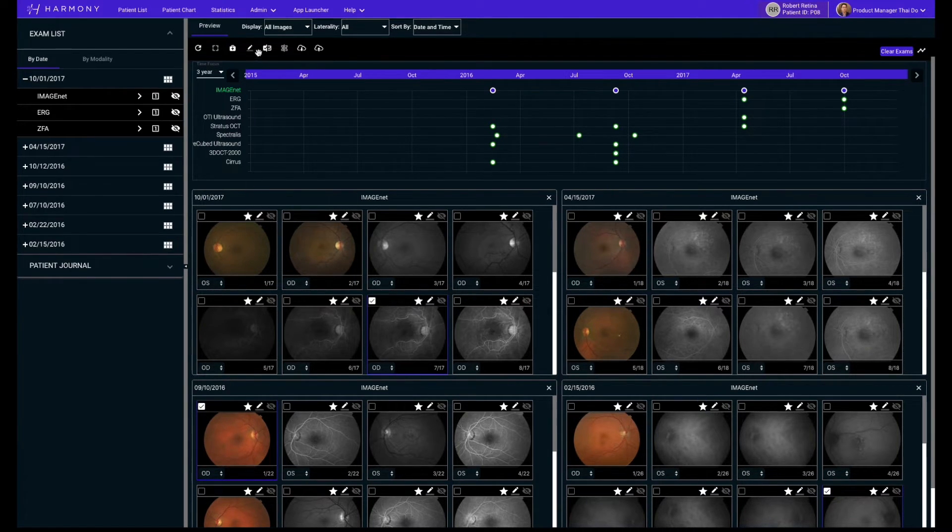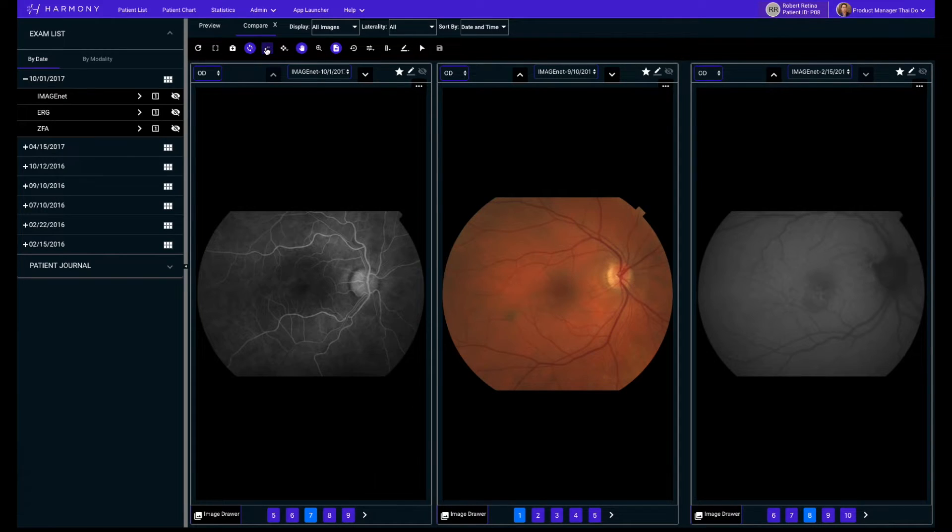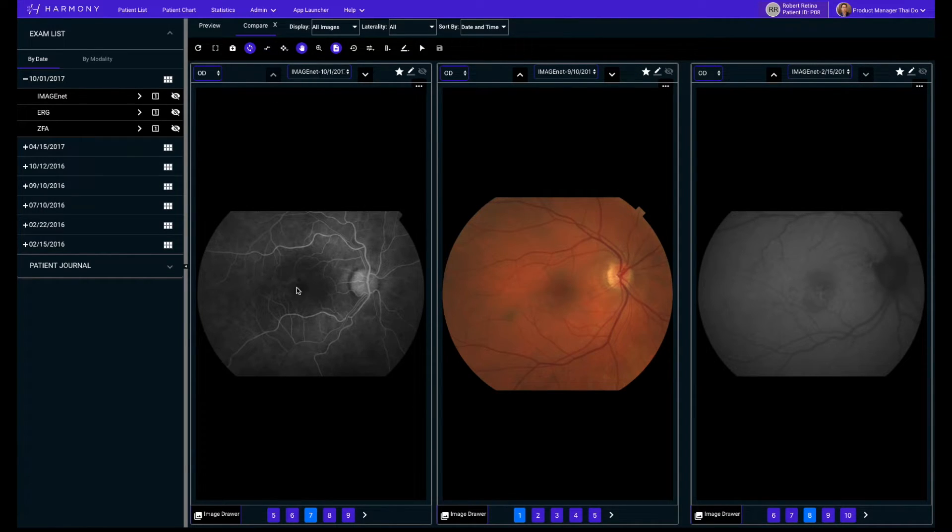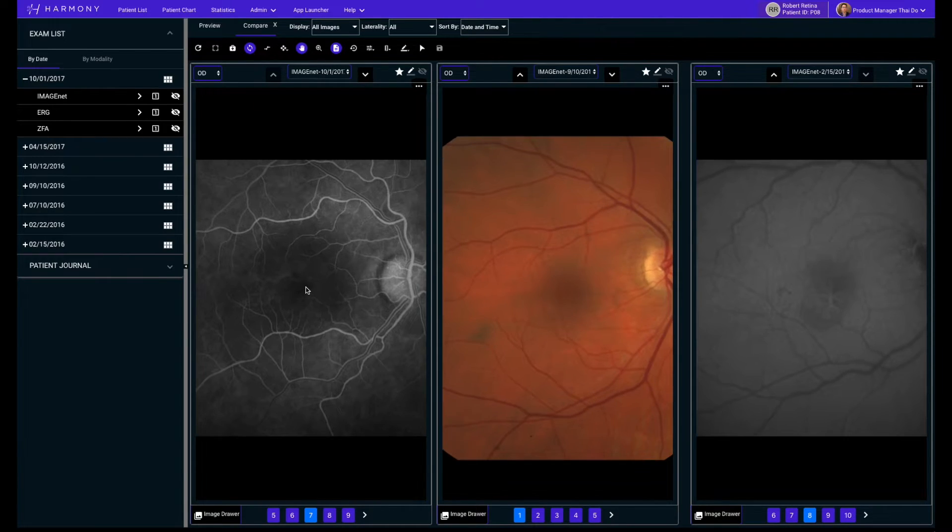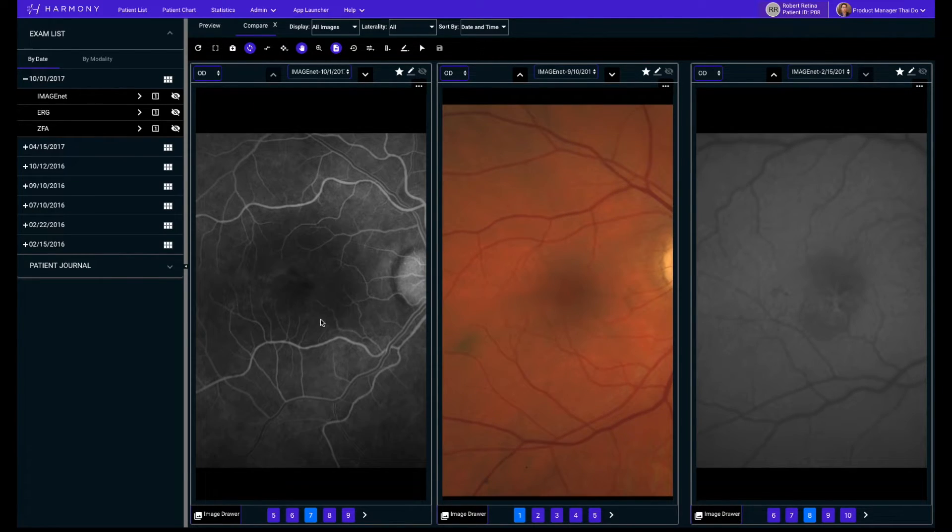The selected images will be displayed on the screen for your review. The sync button lets you zoom and pan all of the images in unison to ensure you're viewing the same area of each image together.